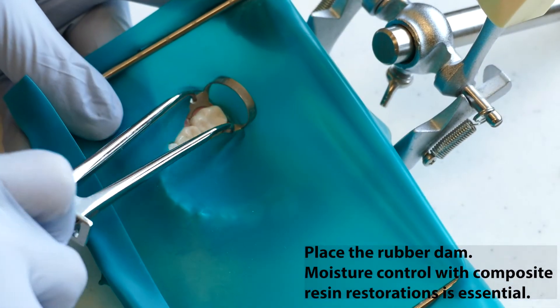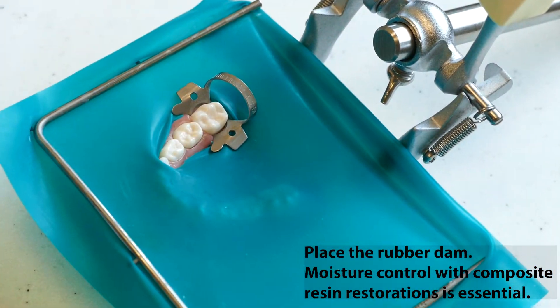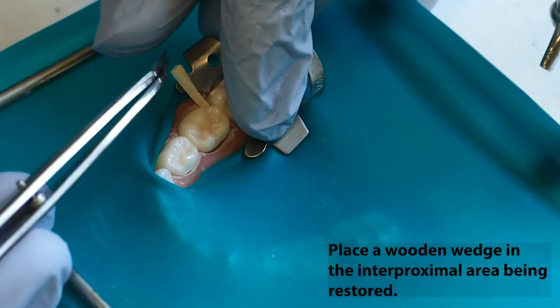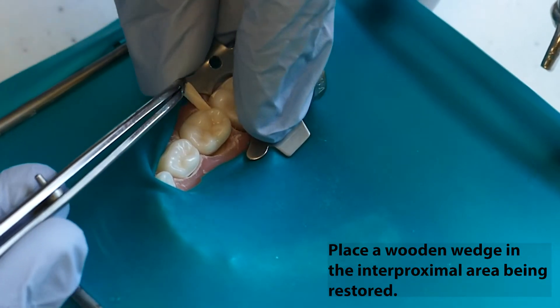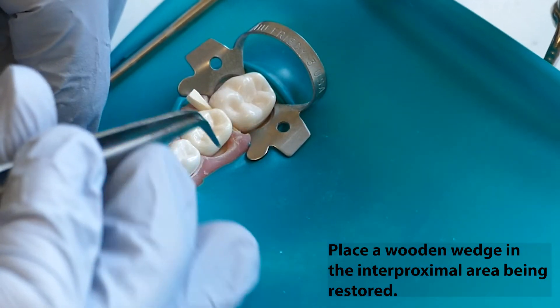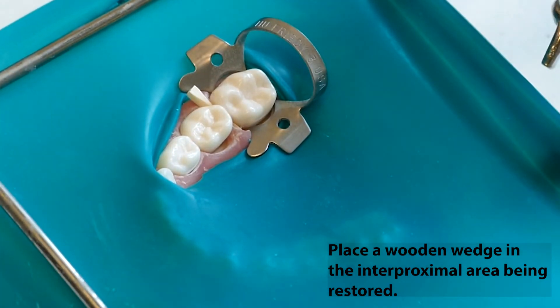Place the rubber dam. Moisture control with composite resin restorations is a must. Place a wooden wedge in the interproximal area being restored. This retracts the gingival papilla during instrumentation, which keeps the operator from cutting the interseptal rubber dam material and underlying gingiva, reducing the likelihood of hemorrhage into the proximal box. It also creates some pre-wedging, which helps to ensure tight proximal contacts of the final restoration.